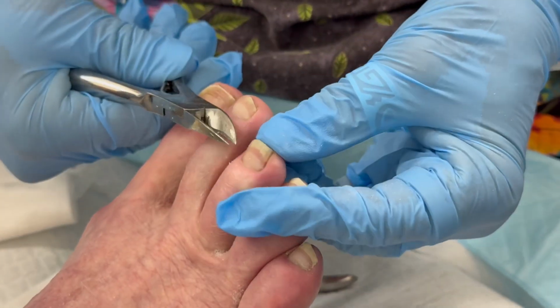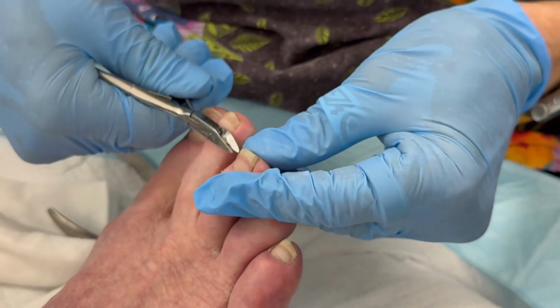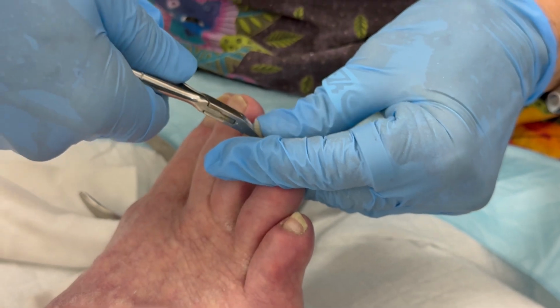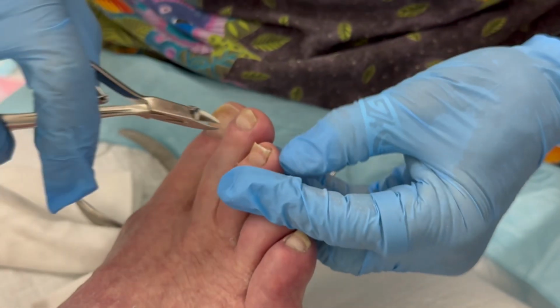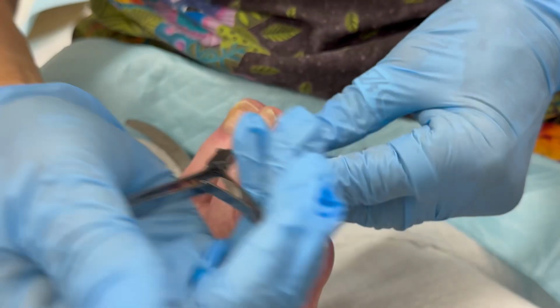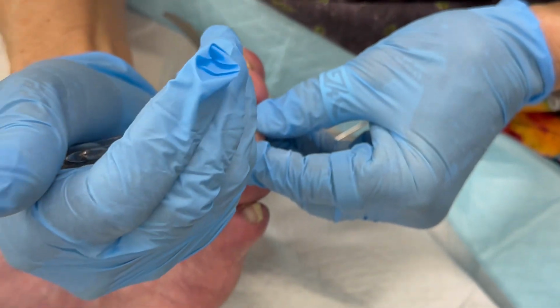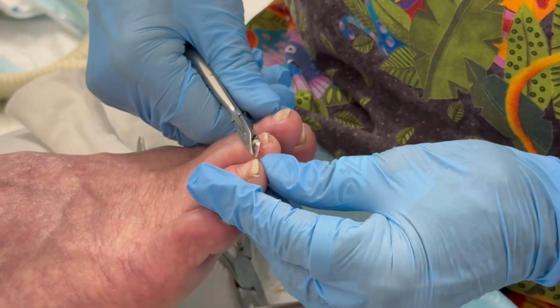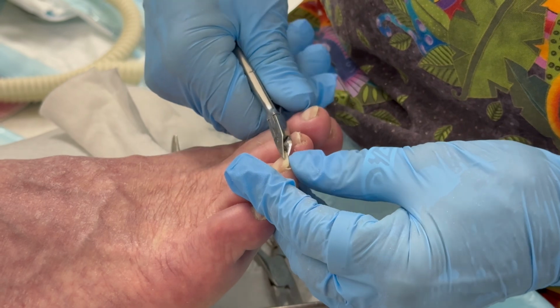So this one, there is free nail border. Actually, I think I'll use my little nippers. For many years on that toe, and from advice from someone, I always cut a little V in the middle. I've heard of that, and if it works, honestly I don't know if it worked or not. I've never done it, but I'll never say no to anything. I did it for quite a long time. Yeah, I did used to hear that in the old days. I've never done it or tried it, but so I'm just cutting across.